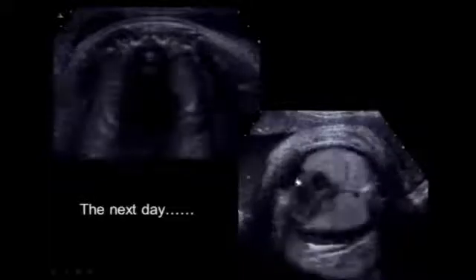completely dry. And here's a video clip of the chest immediately following these two taps, and we were patting ourselves on the back because, wow, we got rid of both of these pleural effusions, not a drop left. These lungs are going to do great. She came back in the next day, pleural effusions both back, skin thickening. This fetus did not have a good outcome.